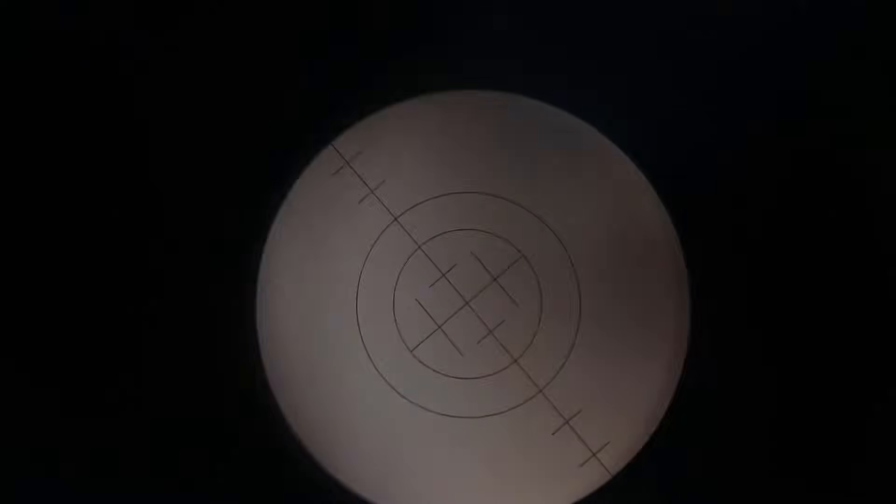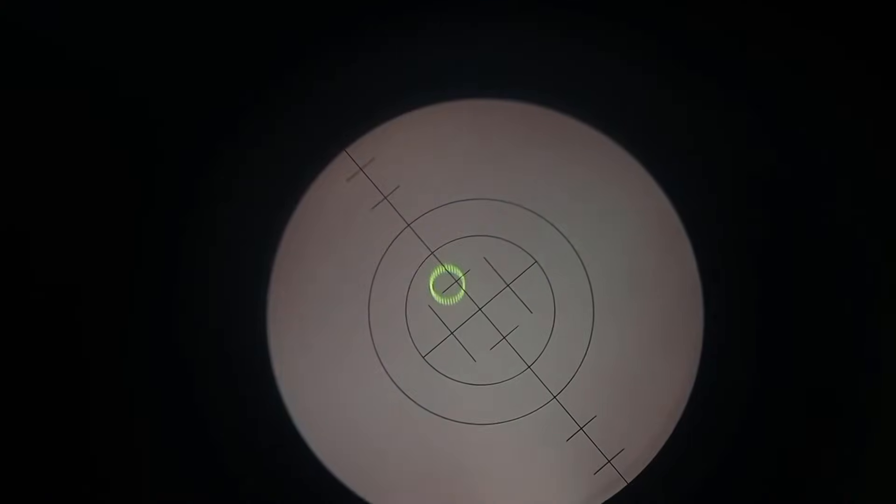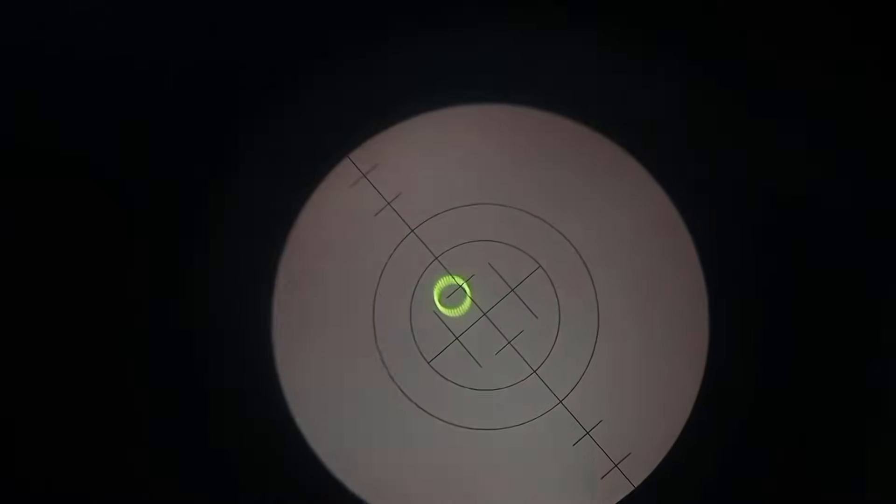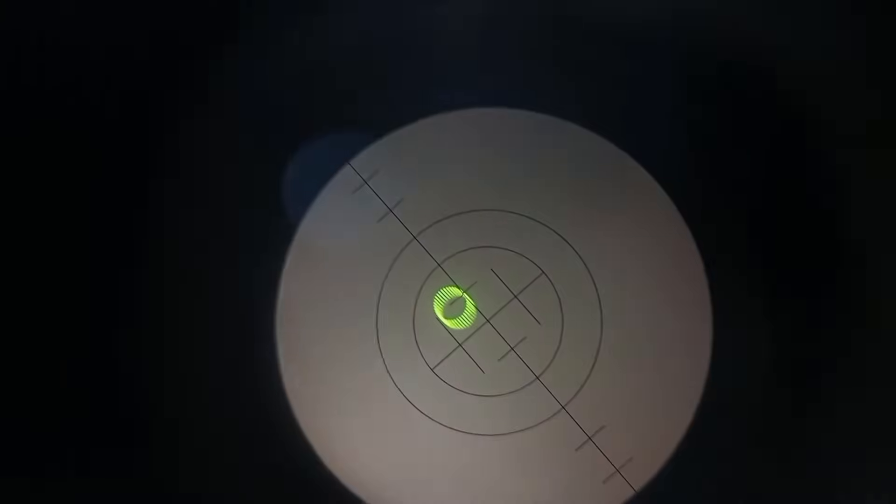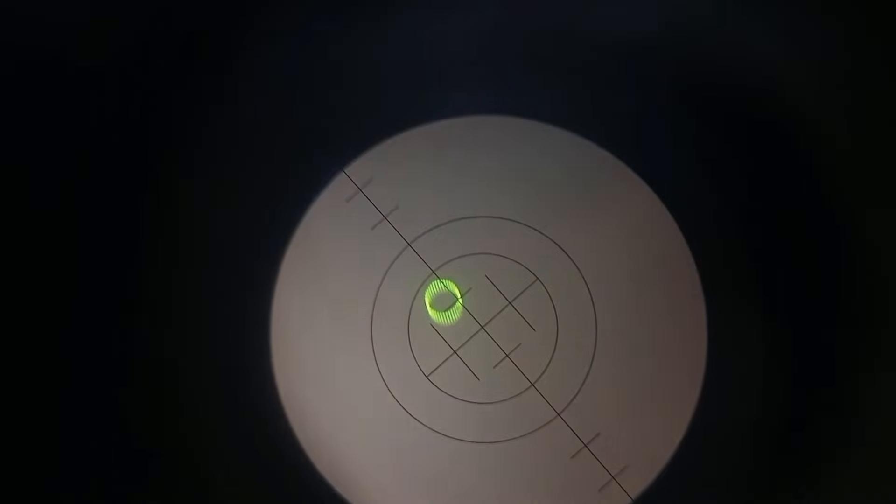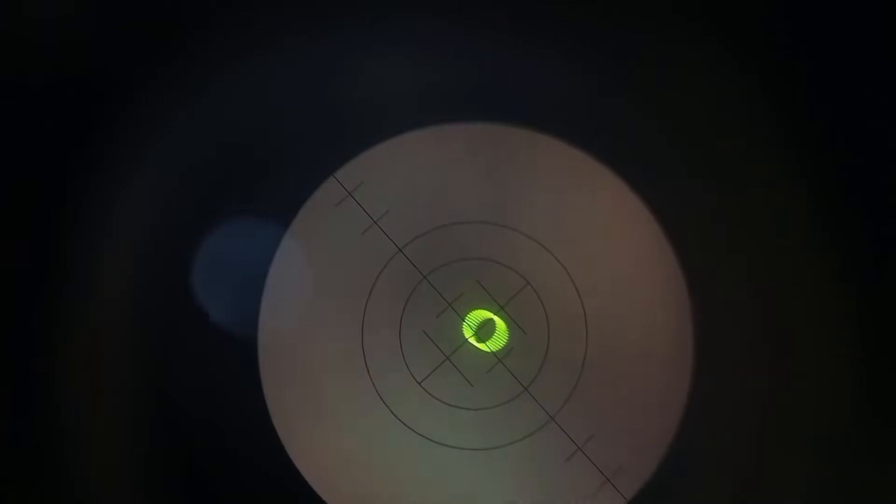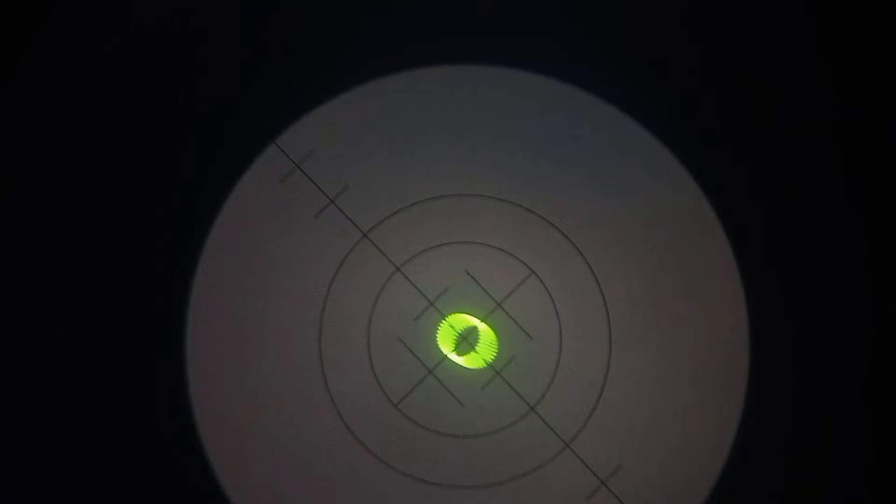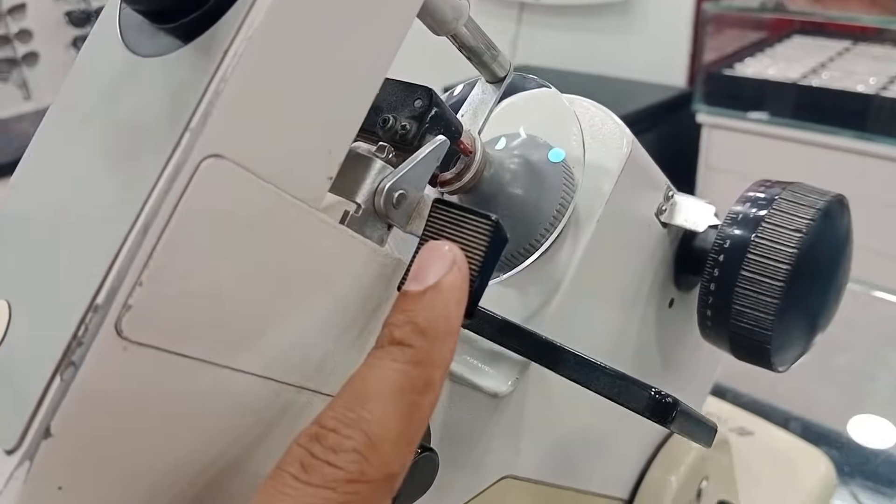And as you can see, I have to align the illuminated bar and the longest line which is at 135 axis. So I am rotating the lens and I have to align both of these. Yes, it's almost there. Now, as you can see, the biggest line, the longest line and the illuminated bar are at the same place. So I will mark the axis.